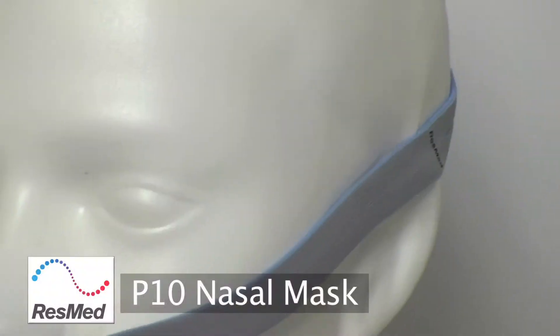Andrew from SleepRite Australia here, and in this video we're going to show you how to change the components of the P10 mask.